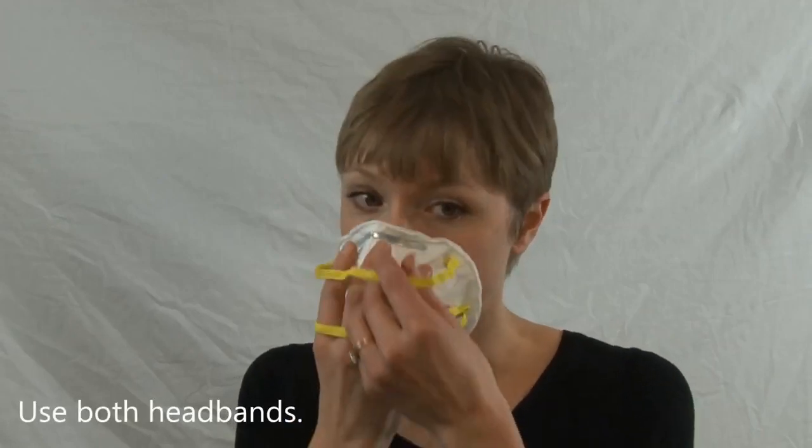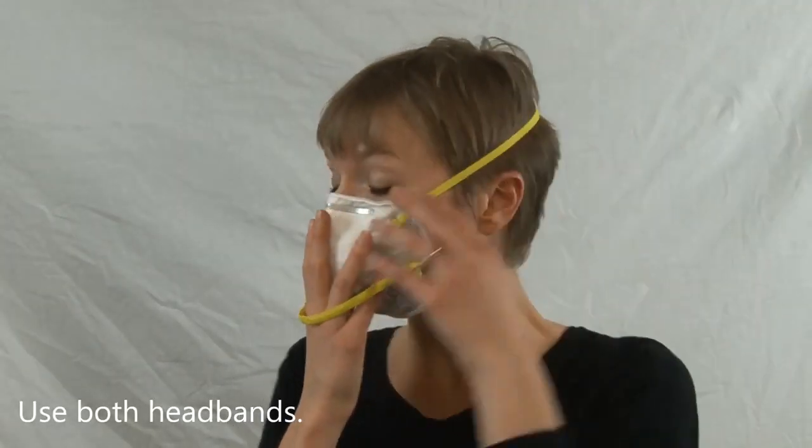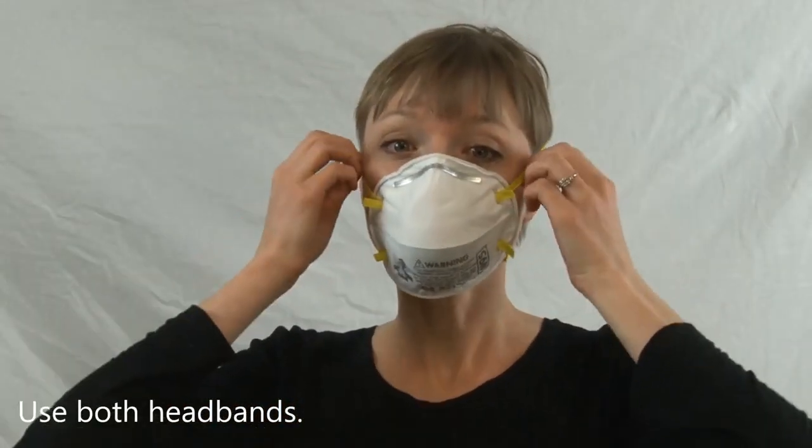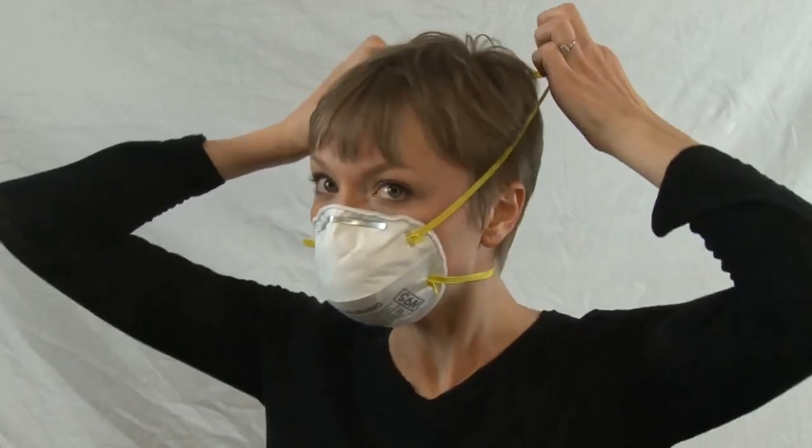Be sure to use both headbands, with one towards the top of your head and the other around the back of your neck. Be sure the edge of the respirator touches your skin snugly.